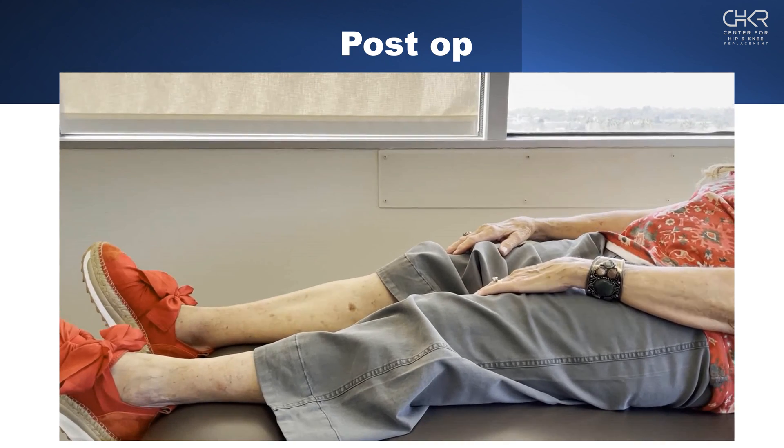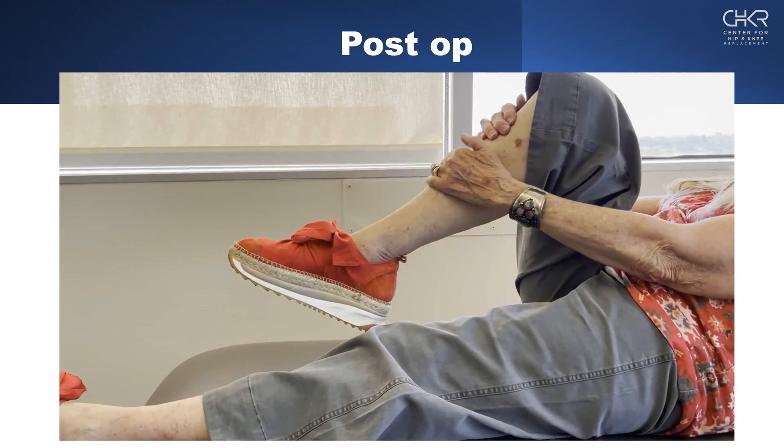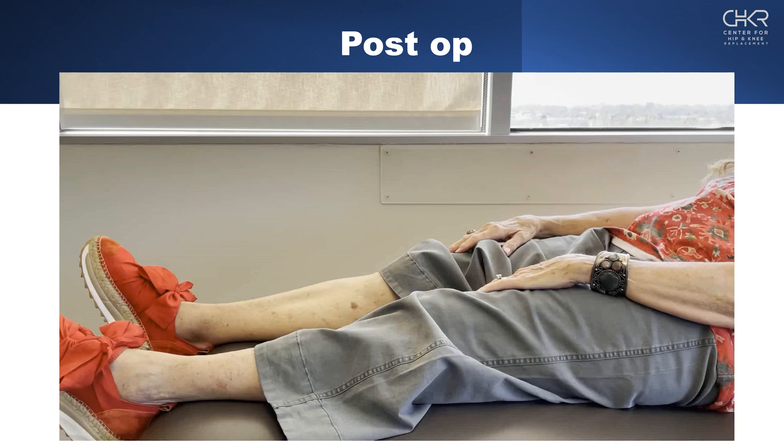At nine weeks follow-up — two months after surgery — she's walking, has good range of motion, good stability, and is able to flex her knee. We've been able to avoid going into her ankle and the proximal tibia for screw removal.